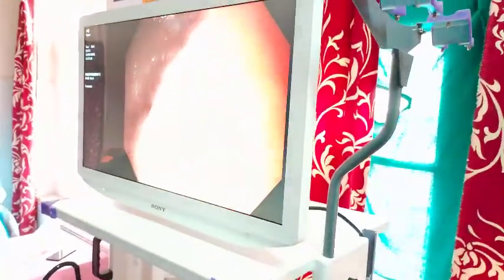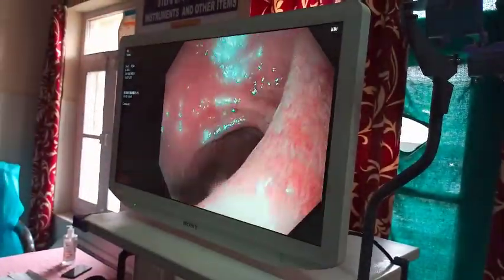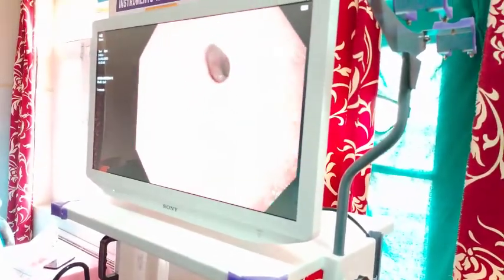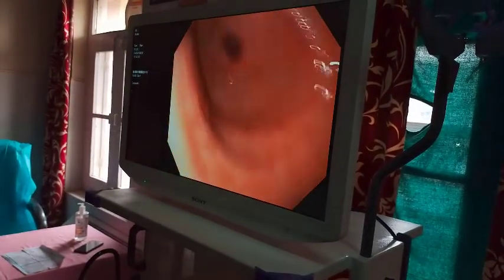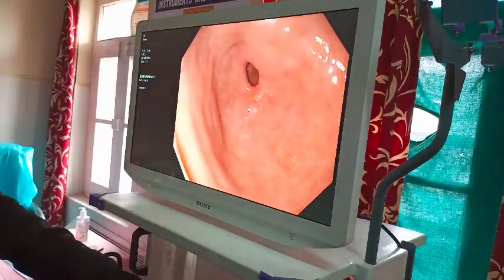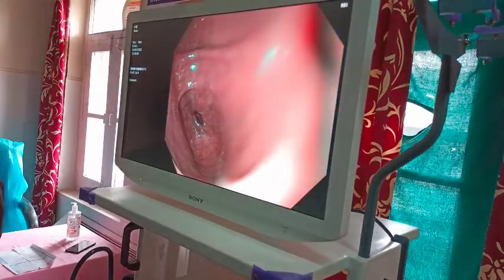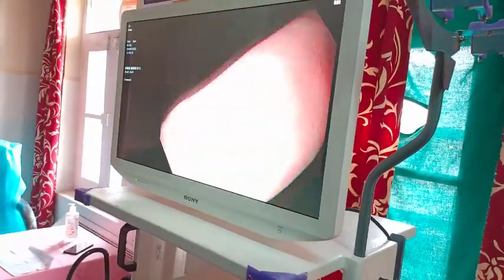We'll come back. Now this is another advantage of this system. You can see we are changing the mode, and it can almost look like a histology. If you have early lesions, God forbid, if somebody has an early tumor... Can you change it back? See the difference. This is without, and this is the narrow band image. Because of these things, early tumors and other things, and the vascularity, different diseases can be figured out, which we never had before.